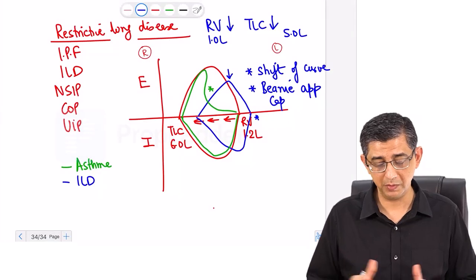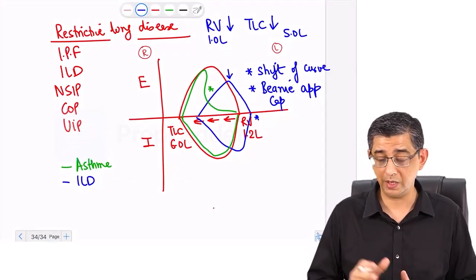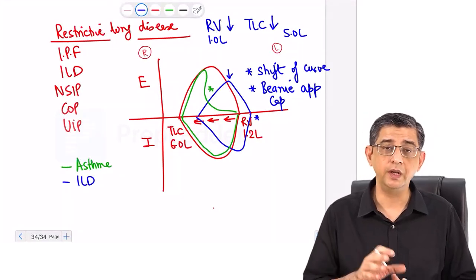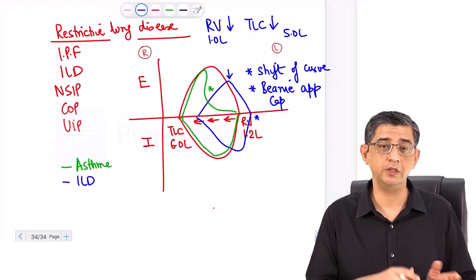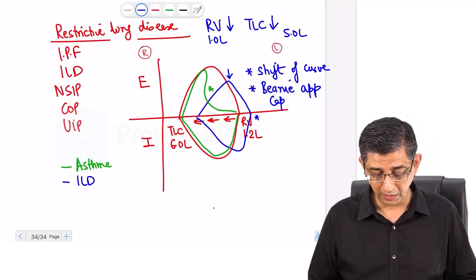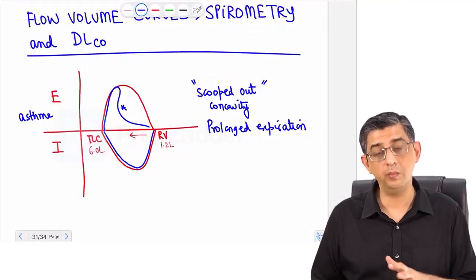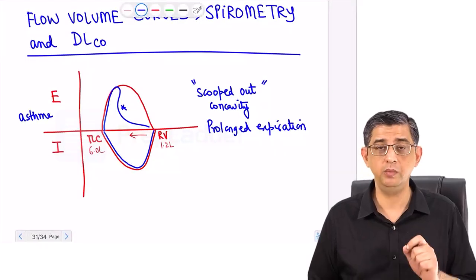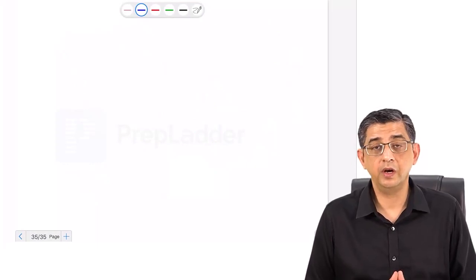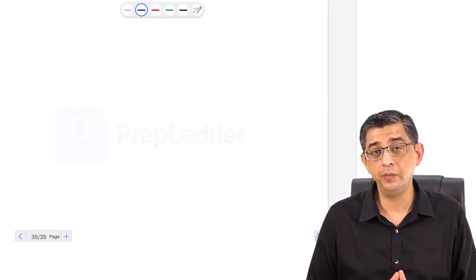And if you just remember this much of information, it's more than sufficient to crack these questions that can be coming. The only thing is, he can trouble you with words like intraparenchymal, extraparenchymal, intrathoracic, extrathoracic. But if you just get the basic concept right for the diagrams that are drawn before you, if you just sketch them once, I am very sure that you will be bang on track to identify questions on flow volume curve. Next, I shall be describing some mathematical aspects related to spirometry.